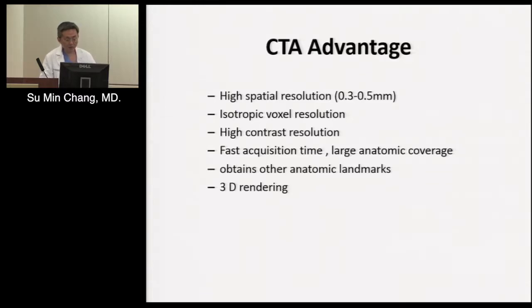High contrast resolution is relative, in the sense that it's obviously better than echo and nuclear, but depending on the patients that we image, it is sometimes not as ideal.